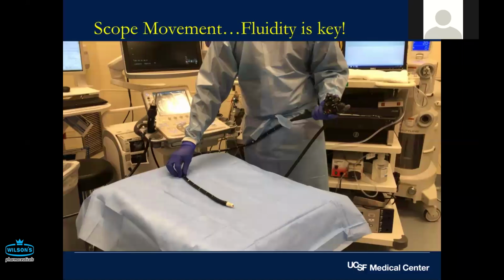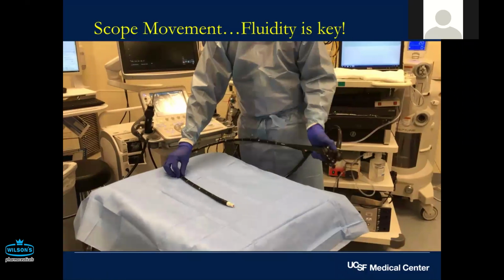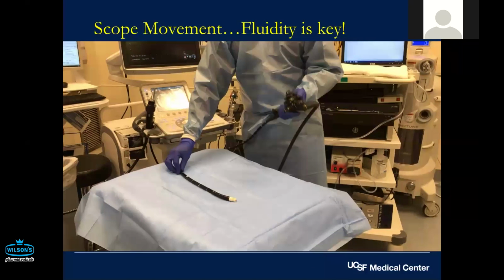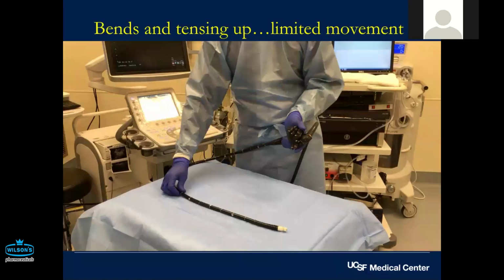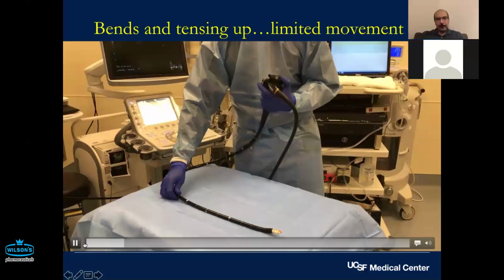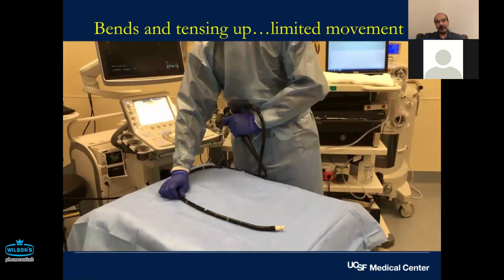So that concept, I just want to play this again. You can see that with the movement of the left hand, the probe is doing a lot of movement in terms of scanning the tissue. Okay, the flip side of it is that if you don't do that and you get very tense on your right hand and you're doing these extreme movements on the left hand, nothing's really going to happen.